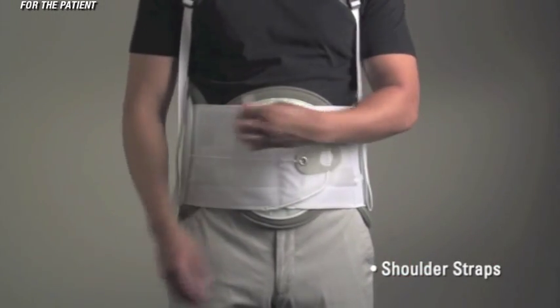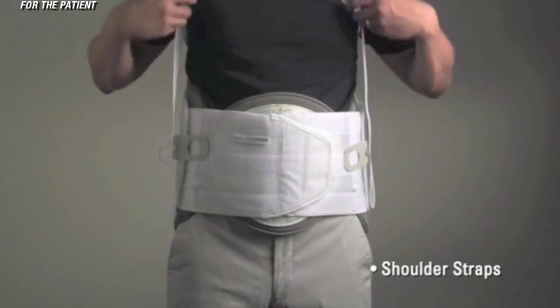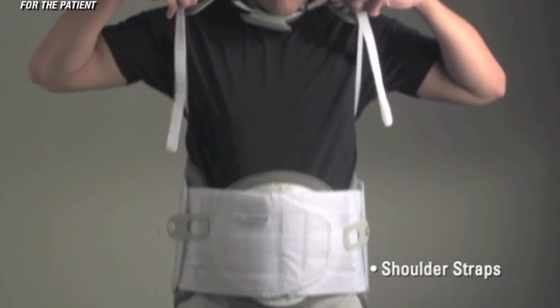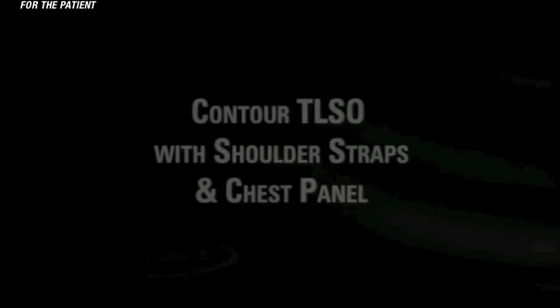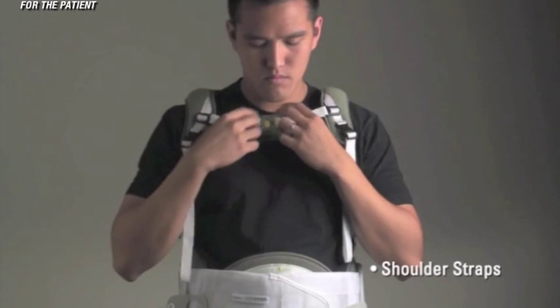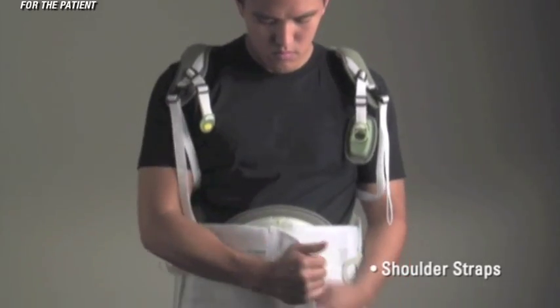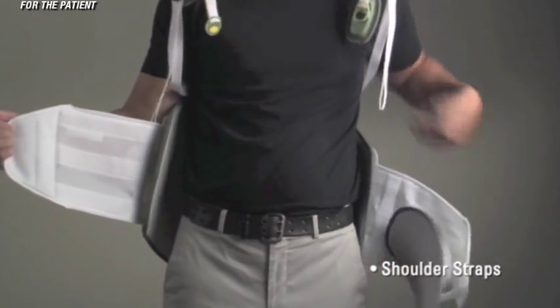When removing the Contour T LSO, first remove the pull tabs and reposition them towards the back of the panel. Lift up on the FasTech buckles, unclip the center strap, open the T LSO, and remove like a jacket.